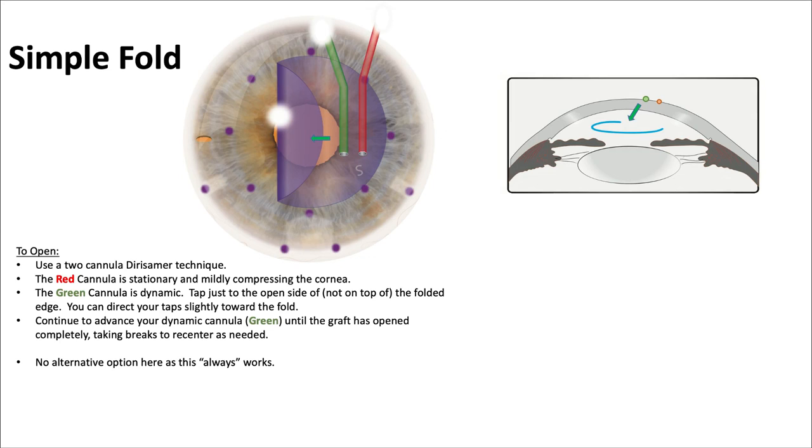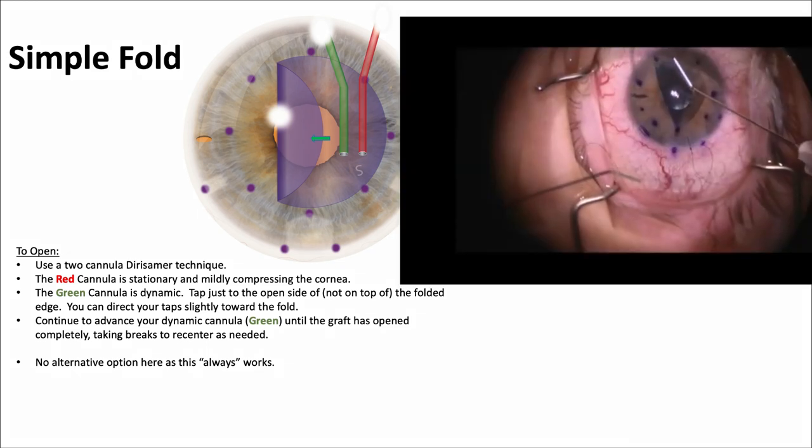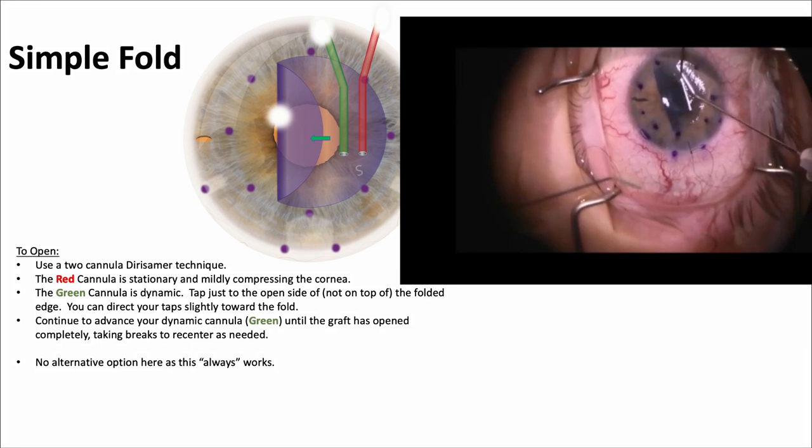For a simple fold, the Derisamer technique is used. That's where the red cannula is held stationary to apply a little bit of compressive force, and the green cannula is the dynamic one that taps gently to send small fluid waves to help open up the graft. This works very well.